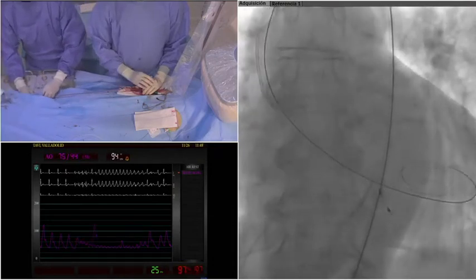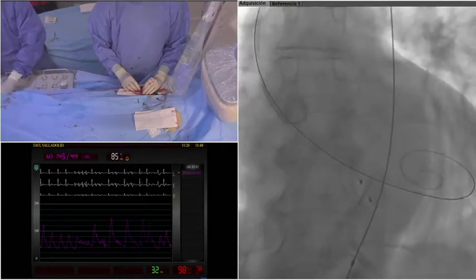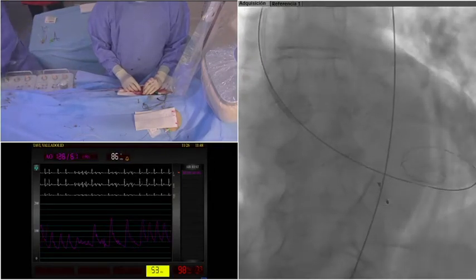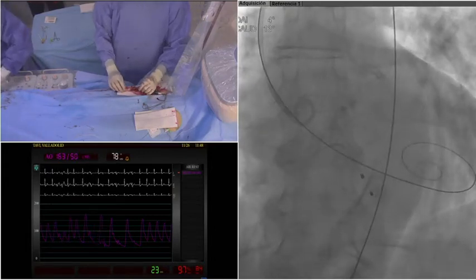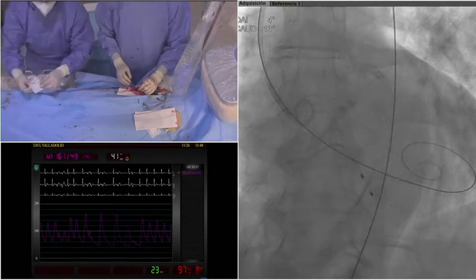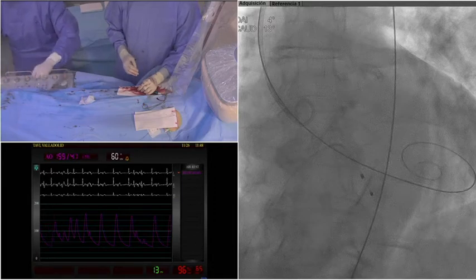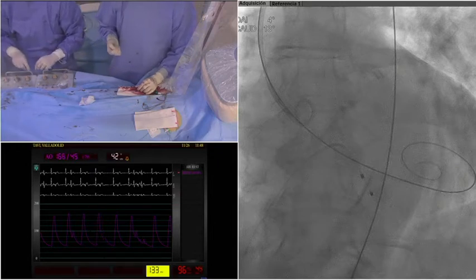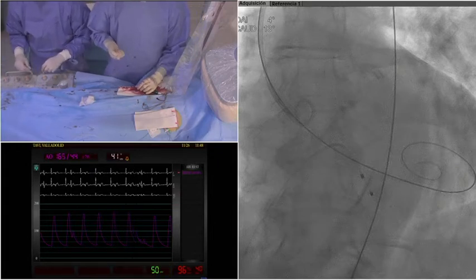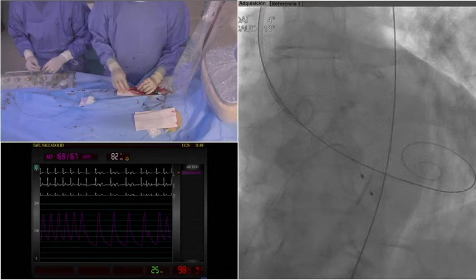Well, actually, in regular life, are you? You said that you were not always pre-dilating the valve, yeah? Yeah. We are using five different types of TAVR devices here. I have to say that when we started using Accurate Neo, we got the habit of pre-dilation because with that prosthesis it is very common to need it. But we have almost abandoned this with balloon expandable valves. Now we think that sometimes when it's very critical, the aortic stenosis, it's not so easy to enter, and you can go abruptly into the LV. I think we can easily avoid this with a mild predilation like this.